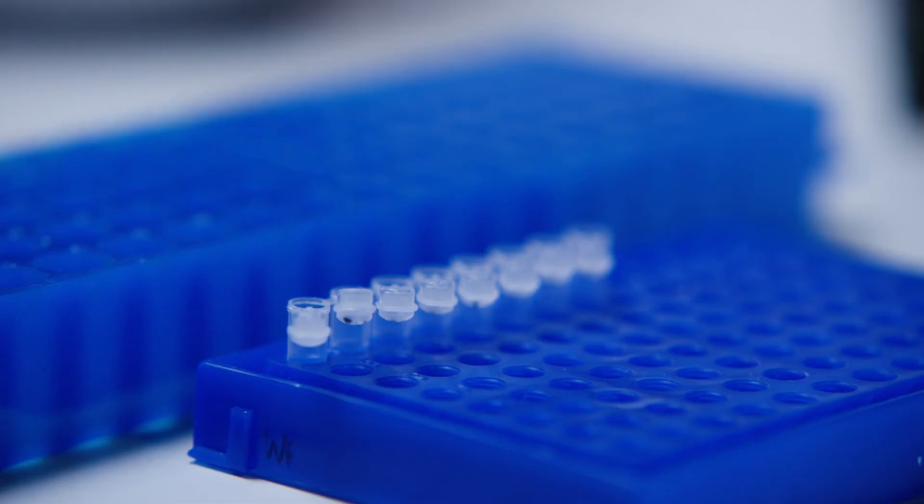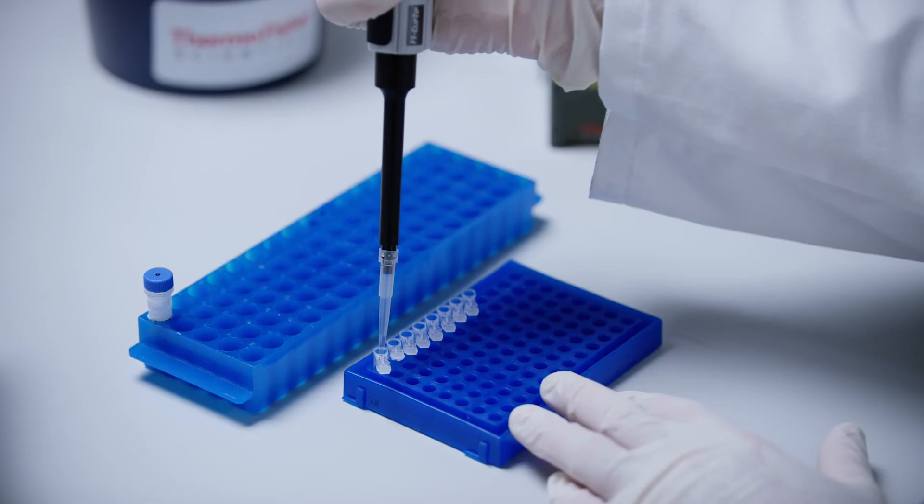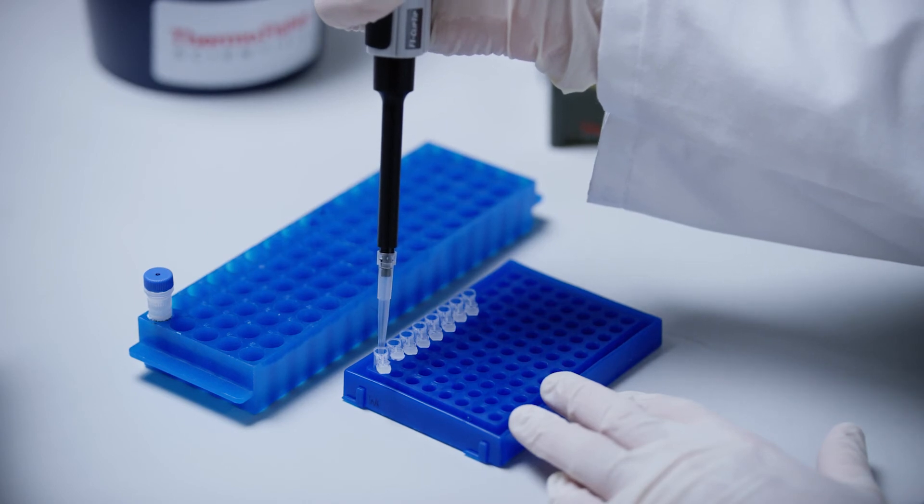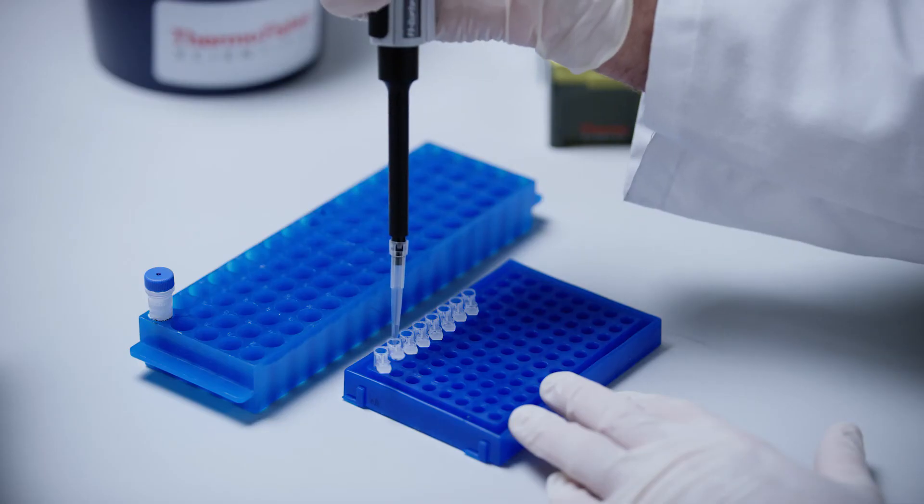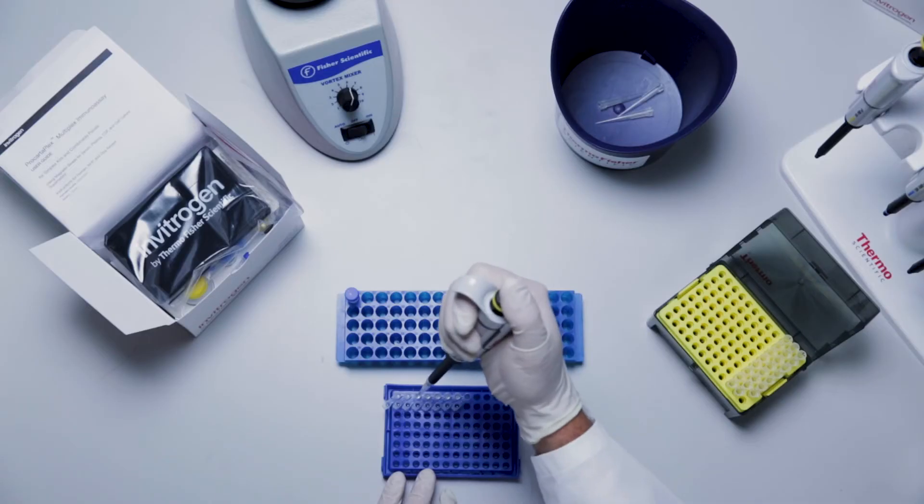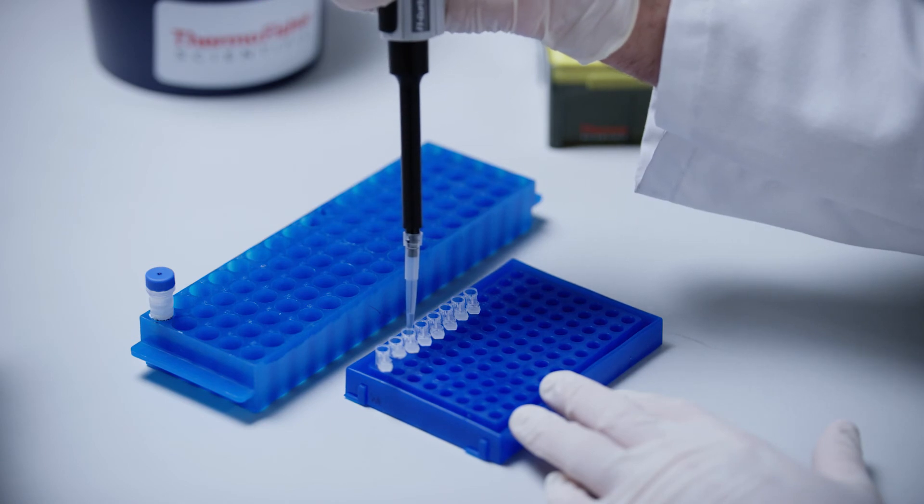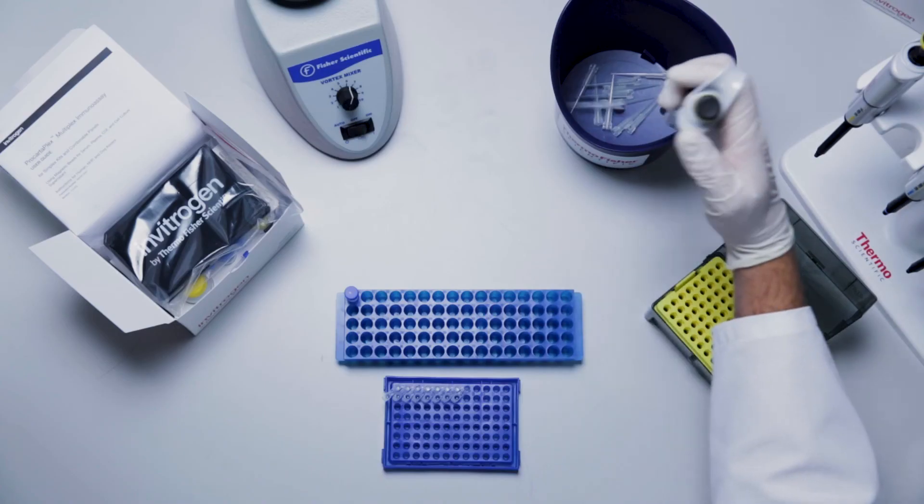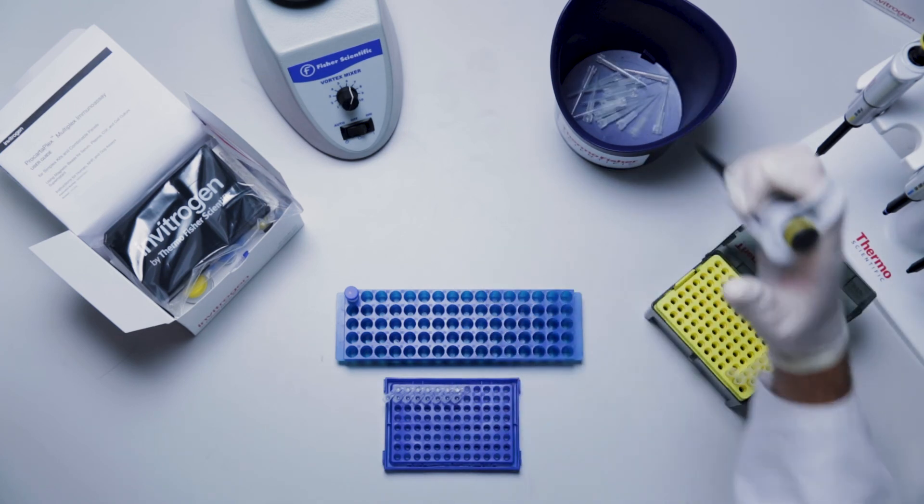Transfer 50 microliters of the mixed antigen standard from standard tube 1 into standard tube 2, mix by pipetting up and down 10 times while changing tips between each tube. Transfer 50 microliters from standard tube 2 into standard tube 3, mix by pipetting up and down 10 times. Transfer 50 microliters from standard tube 3 into standard tube 4, mix by pipetting up and down 10 times. Repeat these steps for the tubes labeled standard 5 through standard 7.